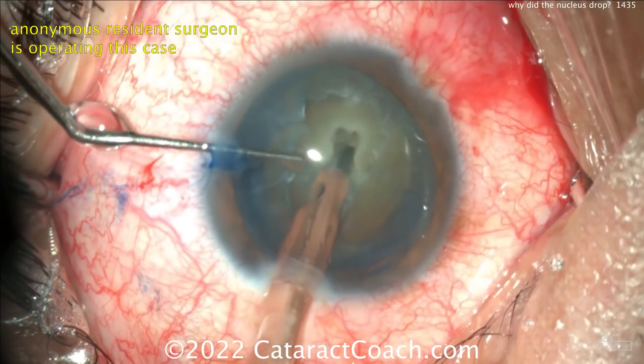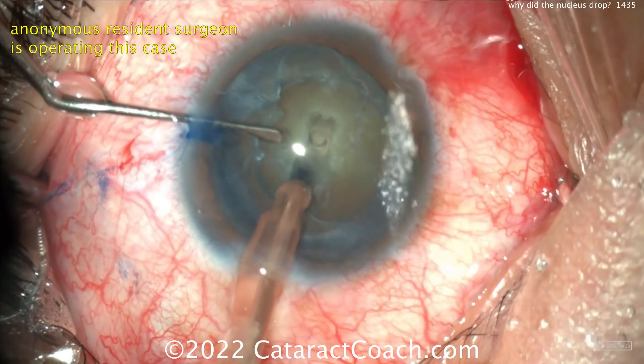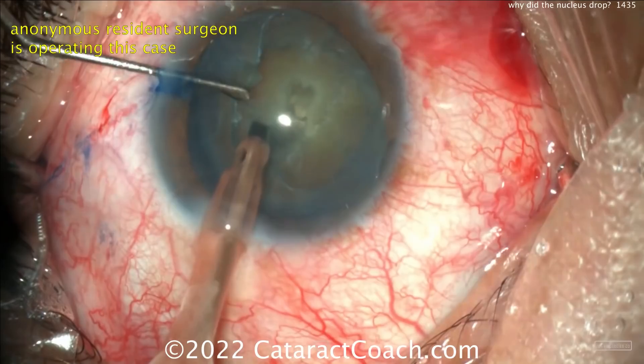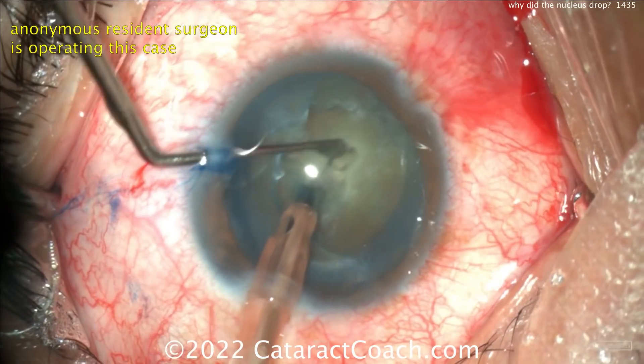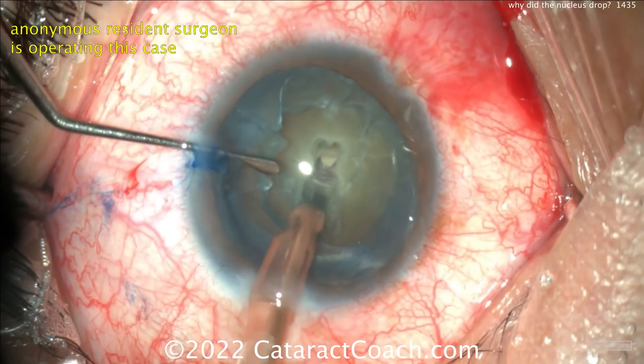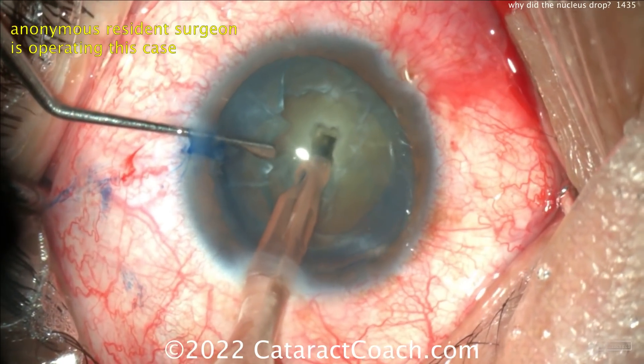This is a little iffy — it's too deep in the middle and not enough length in that groove. Look at that spot — a full thickness defect. The phaco needle has gone through the posterior plate of the nucleus. Now you're in trouble. If I was attending this case, if I was assisting this resident, I would say: stop making the groove. Just stop.